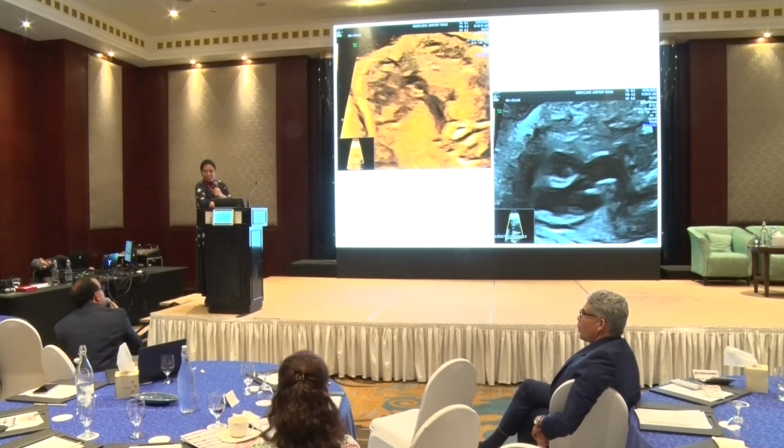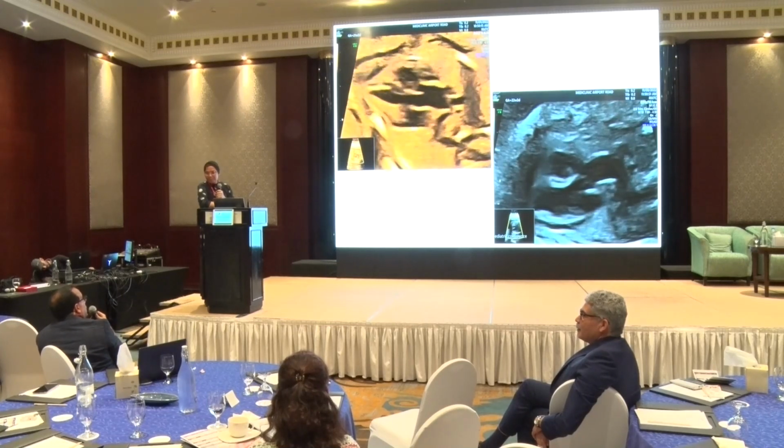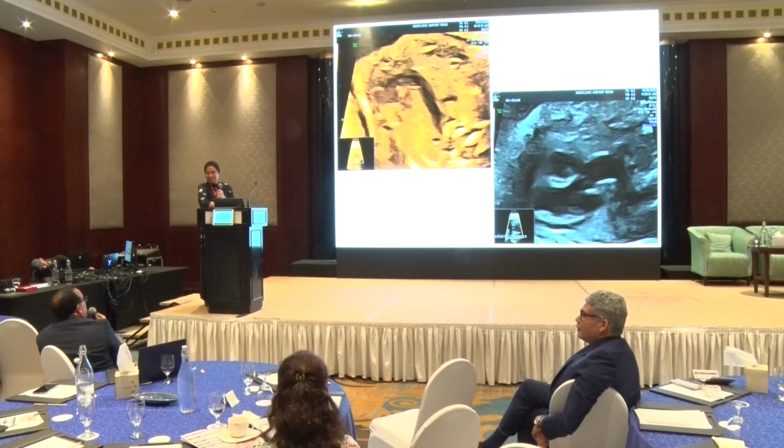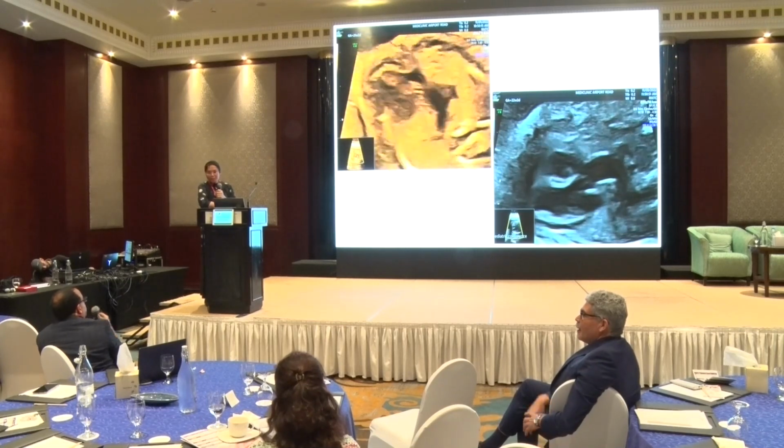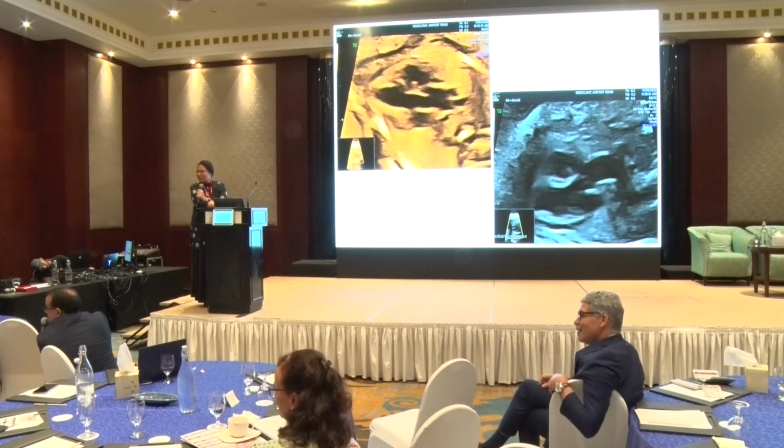And definitely this patient has a small arch. If you can show the arch, probably you can decide if you need prostaglandin later on or not. But probably we can continue to scan. Dr. Diana, please correct me if you don't agree. Feel free.